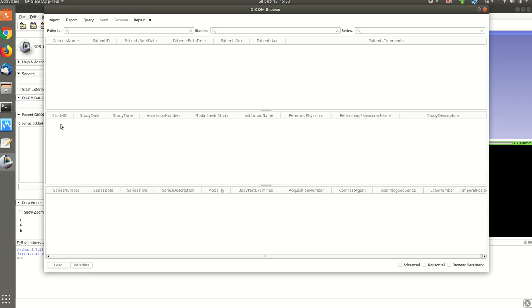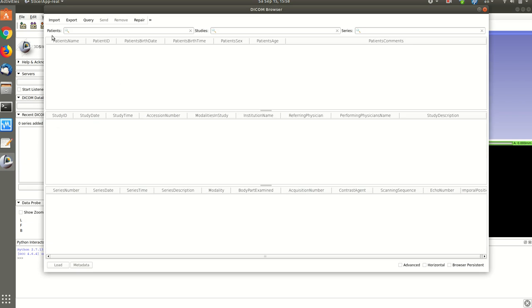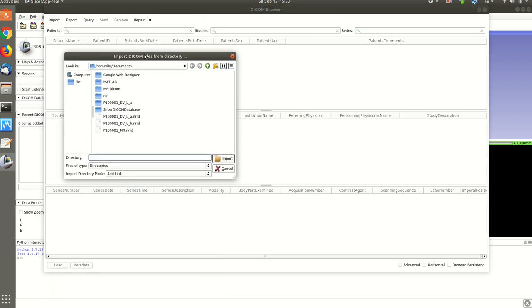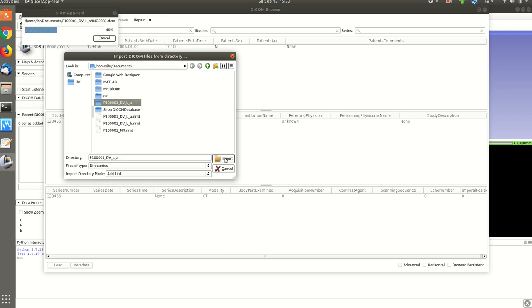Then we import the DICOM image. Let's say we import from the documents, let's say this is a DICOM folder. I import it.